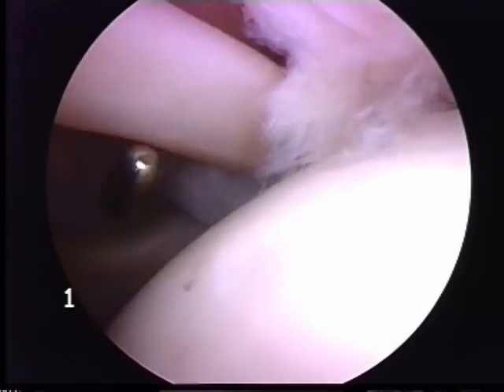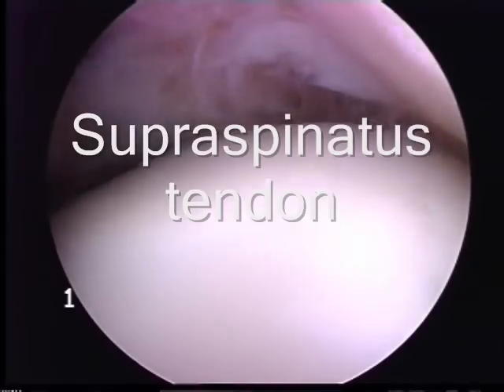This is the humeral head, or the ball, and above it is the supraspinatus tendon — another part of the rotator cuff — which shows some fraying.